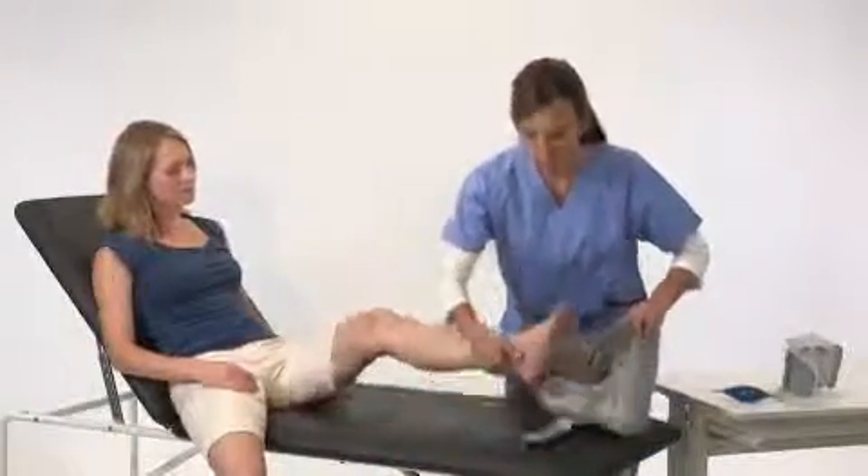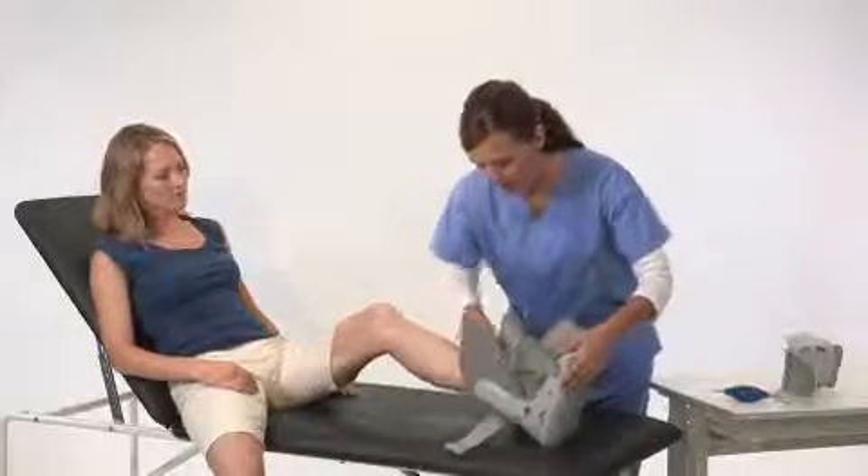While seated, place your foot in the brace and position your heel in the back of it. Pull the liner up to remove any wrinkles.